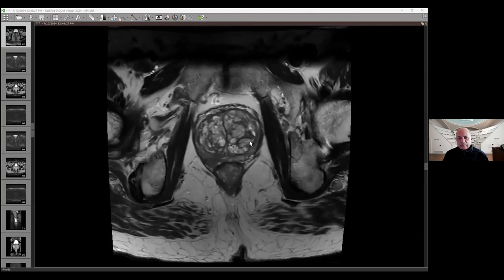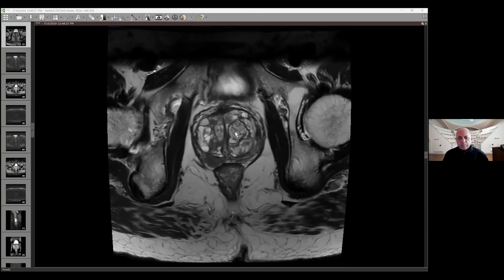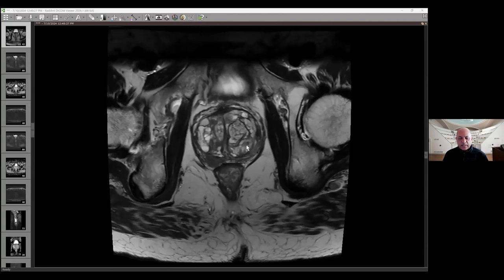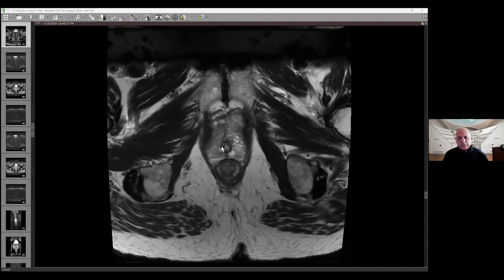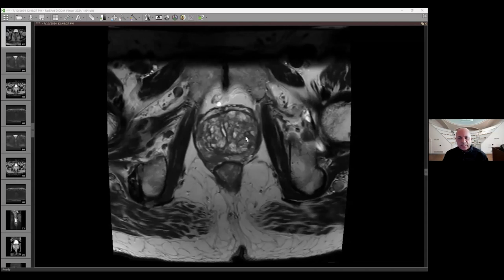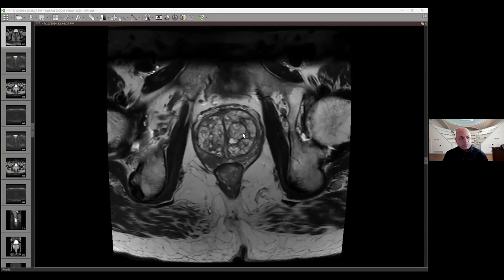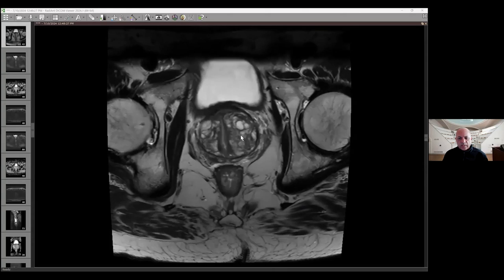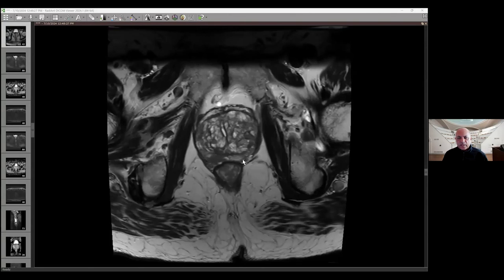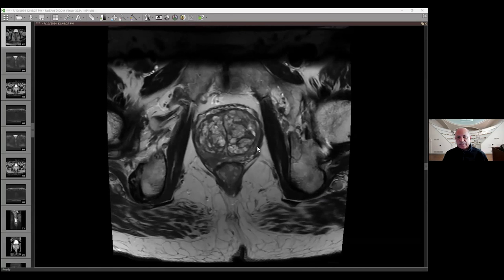BPH comes in three flavors: typical hyperplastic nodules that are bright on T2, stromal components that are dark on T2, and a mixed variety with both stromal and hyperplastic components. The goal is to make sure lesions are very well-circumscribed or have a clearly defined capsule — that tells you it's BPH rather than something to be concerned about. In this case, the enlarging transition zone is pushing and compressing the peripheral zone. On the left side, you can see mixed signal intensity with bright and dark areas, typical in patients who have had prior episodes of inflammation.